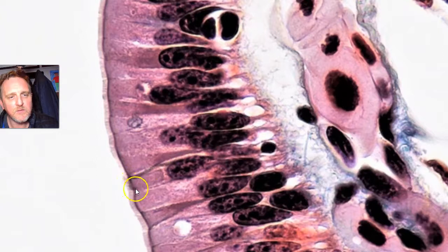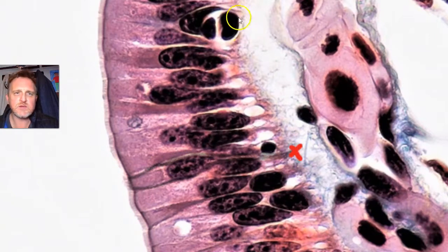We go along here, and if we trace the cell all the way to the bottom, we'll see that it actually does, over there, we'll make a little red cross, rest along the basement membrane. In fact, all the epithelial cells come to rest on this basement membrane.